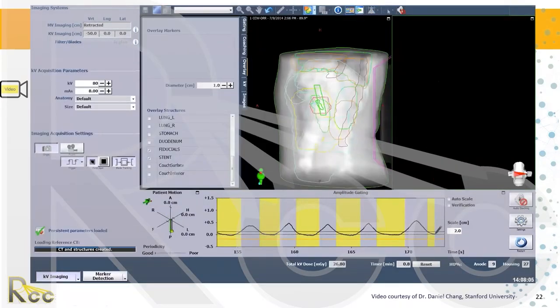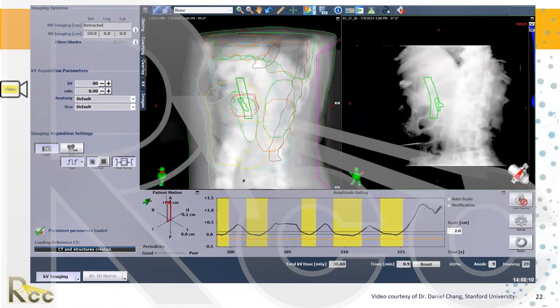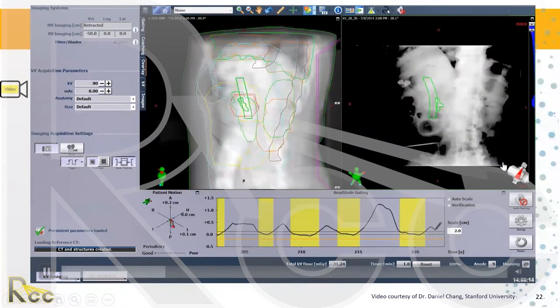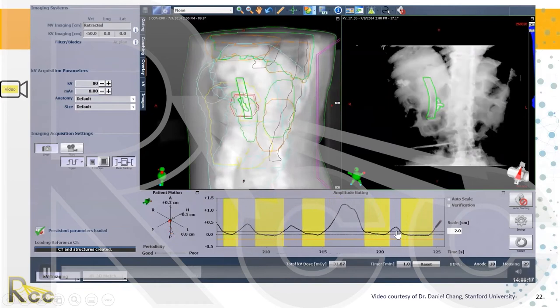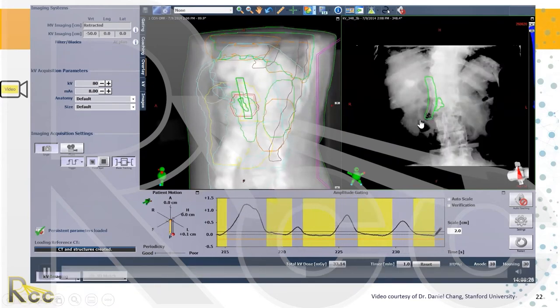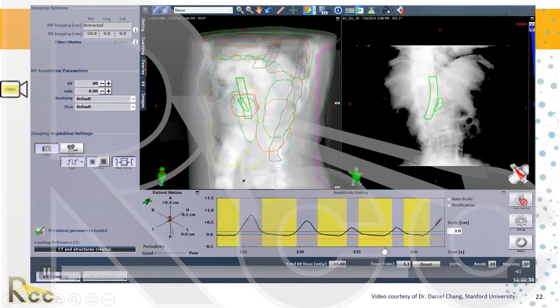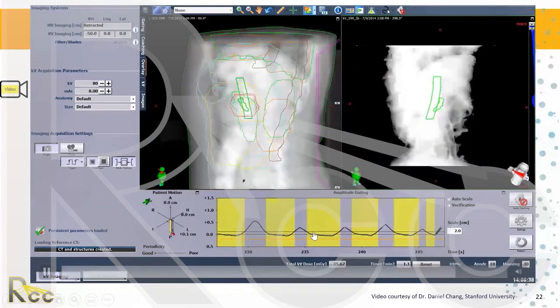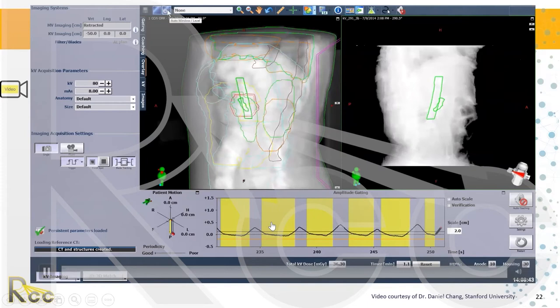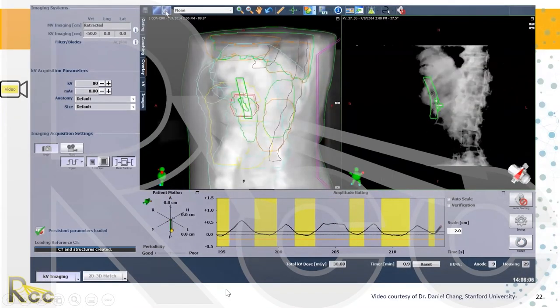Another example shows a stent and fiducials in a green area. As the gantry moves around the patient, we can see the breathing pattern and when the beam is on. When the breathing is within the full threshold, the beam is on for that longer duration. The software controls when the beam turns on and off to match the planned treatment phase.